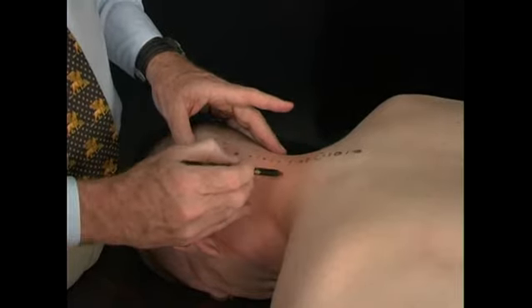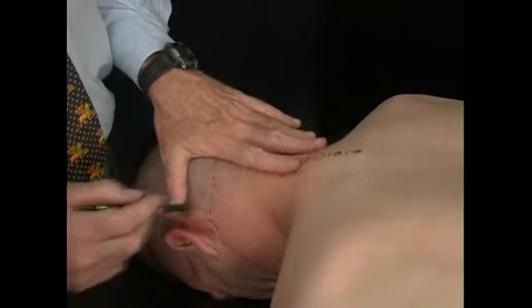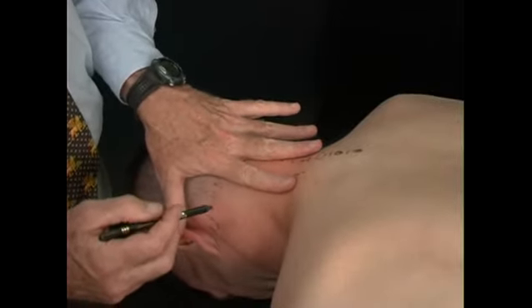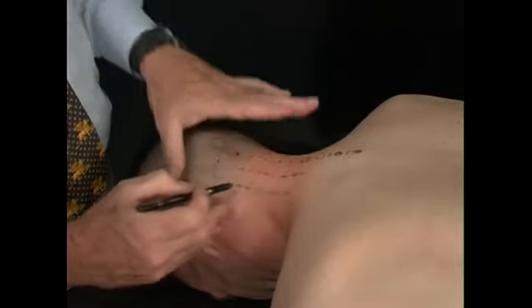And so our second line runs just in a line down, again about a finger breadth off the spinous processes. Our next injection area is the area of the facets, and the facets are 2 finger breadths off the spinous processes. And so we make a second line.